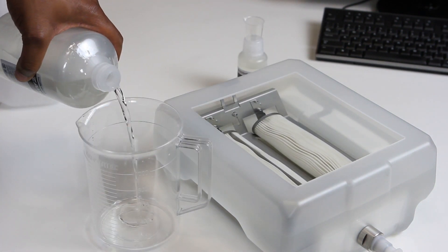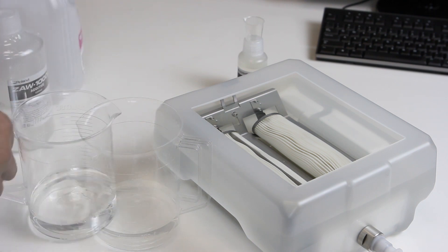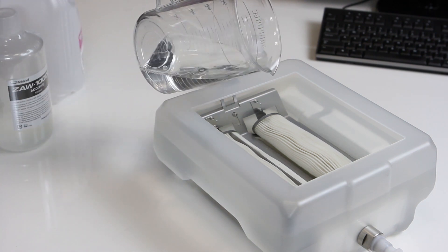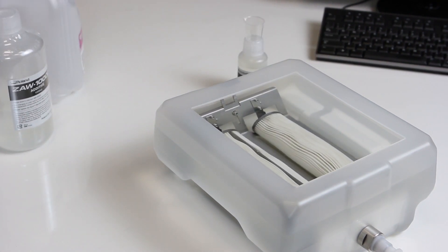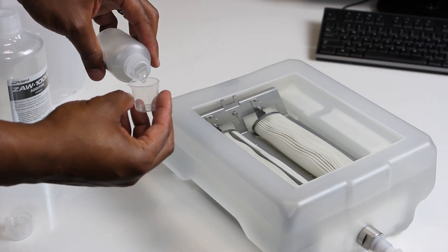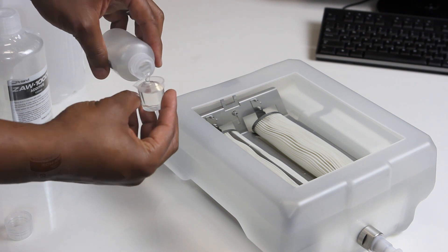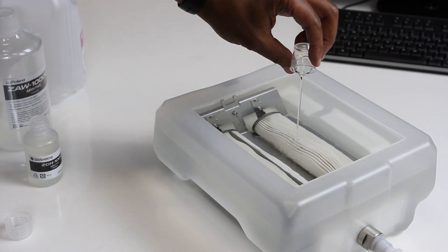Next, pour in 250 milliliters of coolant additive. Finally, using the small measuring cup, pour in 12.5 milliliters of chelate agent.